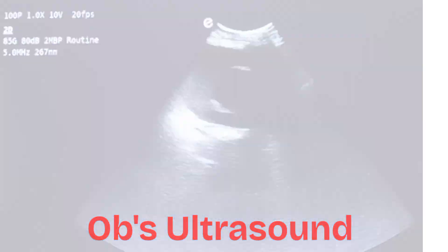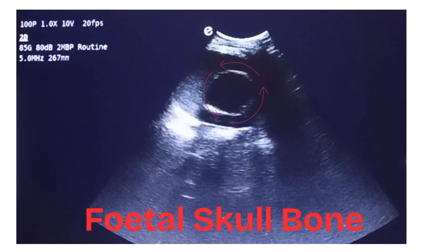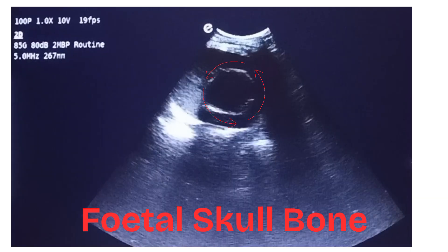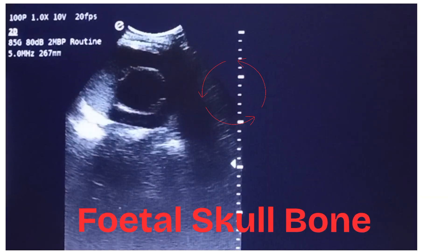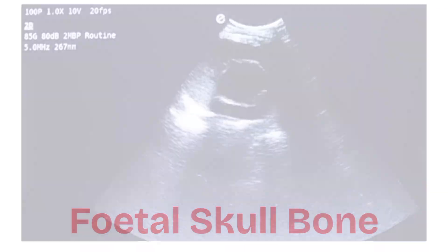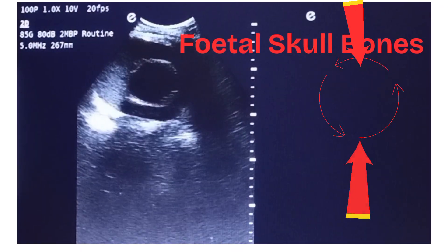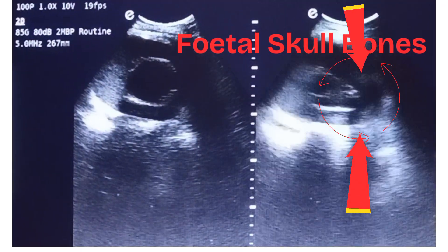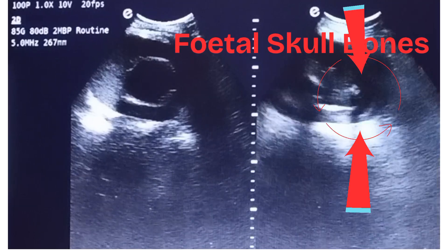Fetal head can be seen here within the red arrows. Fetal skull bones can be seen here, with both arrows indicating the fetal skull bones.